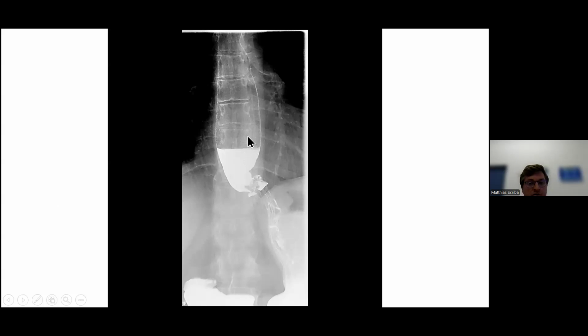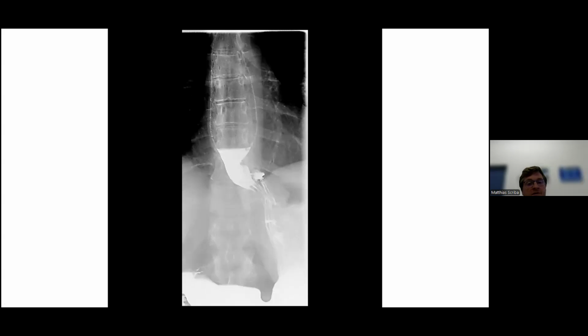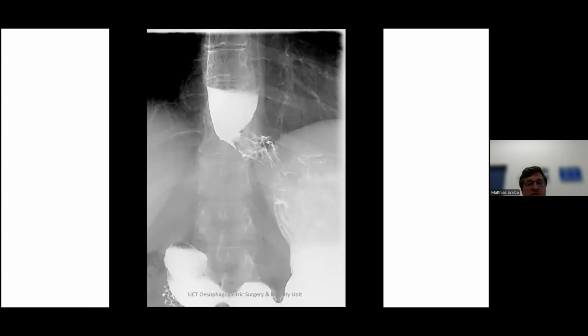So a usual vertebral body in an average adult is around 4 centimeters. And the esophagus should really never be more than 2 centimeters. It should never be more than 50% of that. And in this case, we can see that it's not just more than that, it's actually greater than the vertebral body. So this is significant dilatation. You can all see here that there is certainly a small recurrence, not a very big one, but looks like a recurrence. And this is another still, and I think I have one video to show.